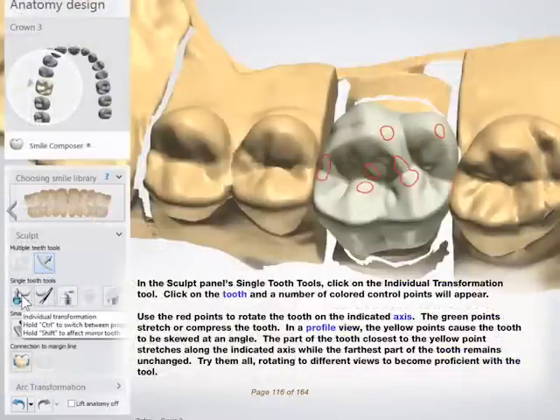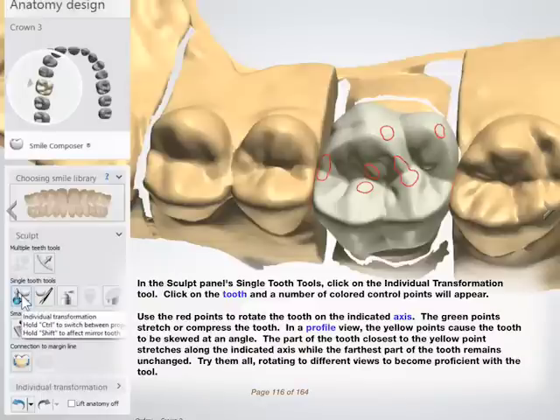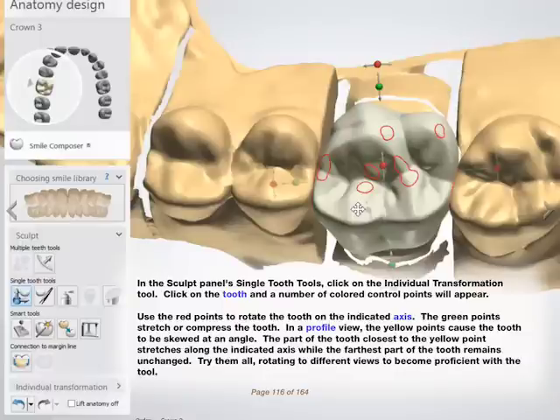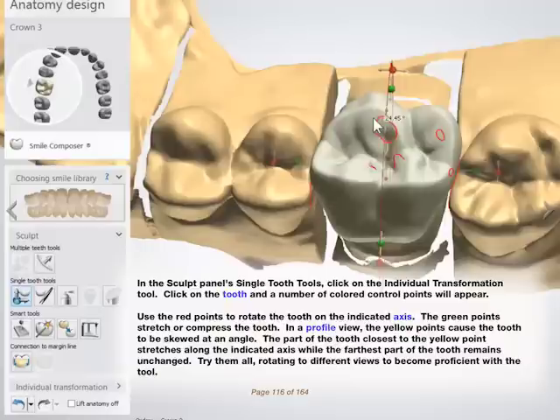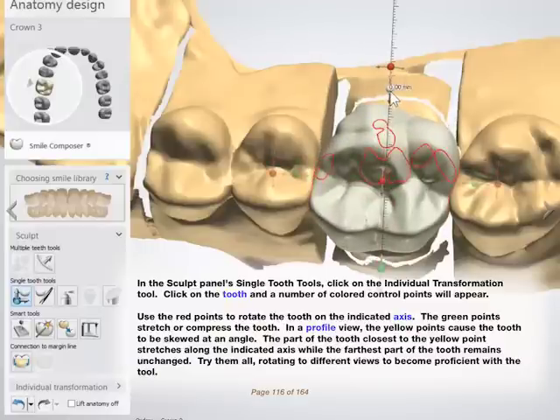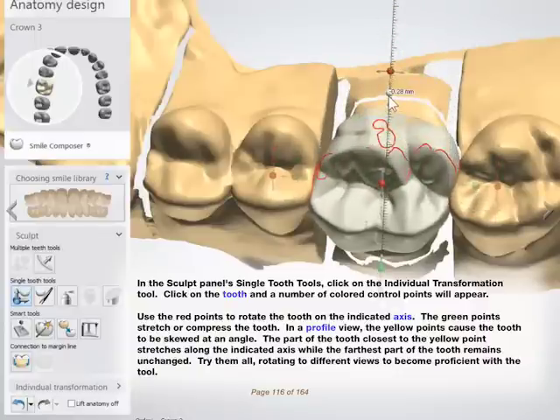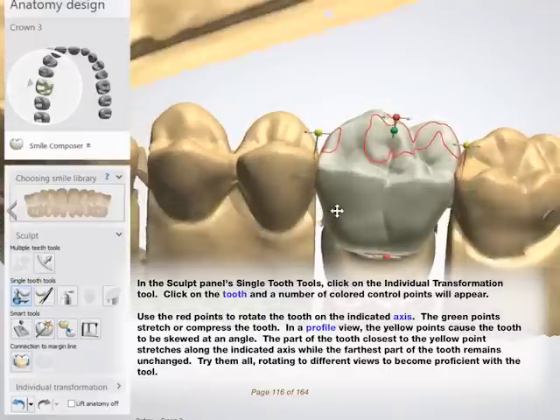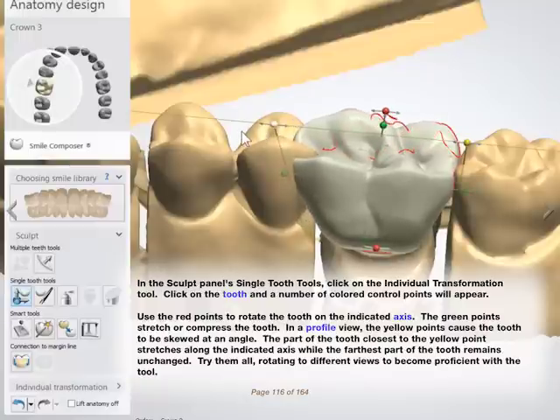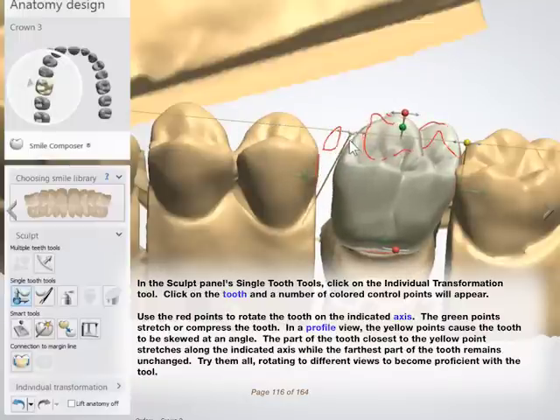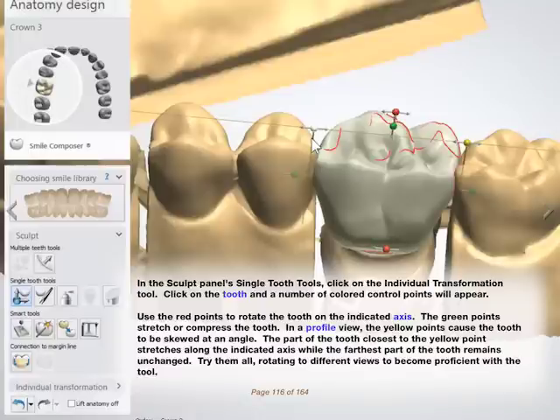In the Sculpt panel's Single Tooth Tools, click on the Individual Transformation tool. Click on the tooth and a number of colored control points will appear. Use the red points to rotate the tooth on the indicated axis. The green points stretch or compress the tooth. In a profile view, the yellow points cause the tooth to be skewed at an angle — the part of the tooth closest to the yellow point stretches along the indicated axis, while the farthest part remains unchanged. Try them all, rotating to different views to become proficient with the tool.